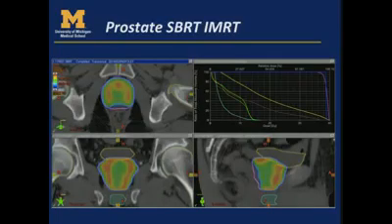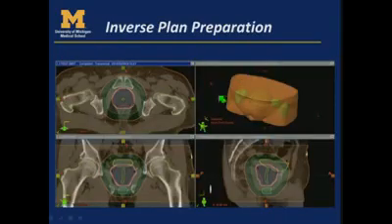So here again, you'll see that the dosimetrist has registered the scan where they had the Foley in, and so here's the urethra in green. As Mary said, this can change depending on the patient. It's a little bit hard to see, but this purple is the PTV, and then in red, the dosimetrist has created a treatment planning PTV. Here he's excluded the rectum and made a 1 millimeter margin around the PTV to really ensure good coverage right at the edge. So that's something your inverse planning system may struggle with.